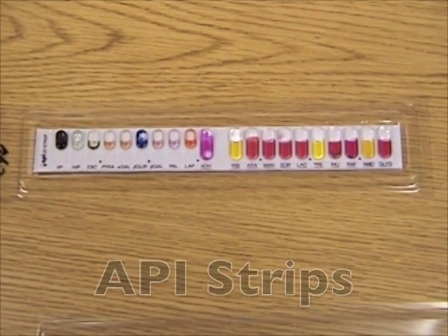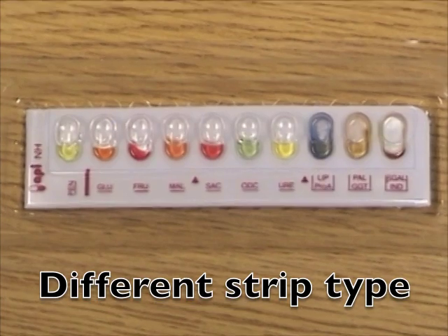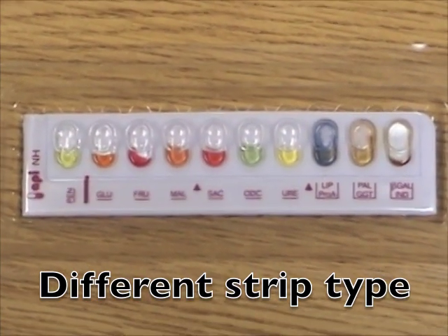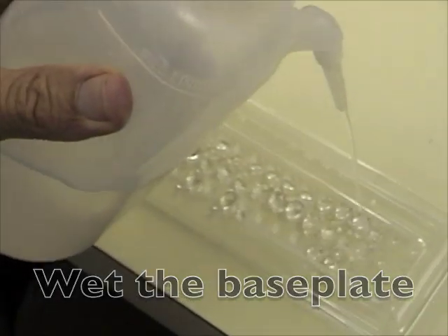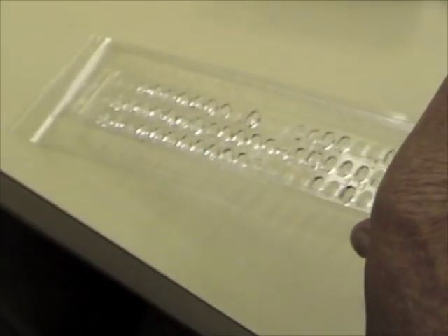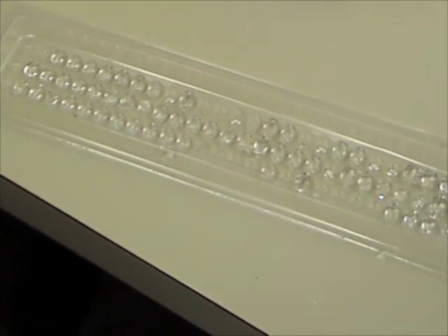API strips allow you to test all kinds of things to identify your organism. Some of you will have to have a humidified chamber, and for those of you who do, you'll have to add some water. Move the water around so that you don't have large puddles.